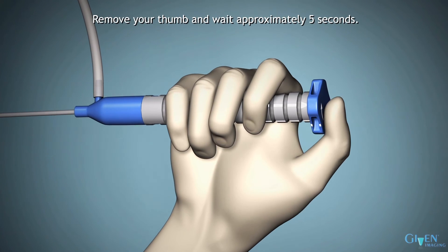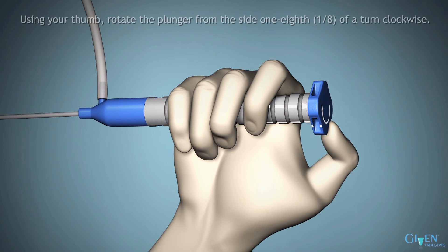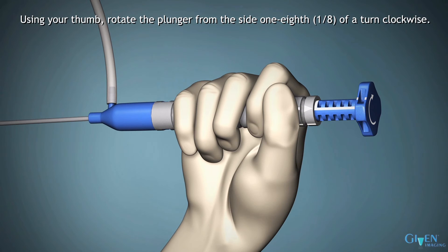Remove your thumb and wait approximately 5 seconds. Then, using your thumb, rotate the plunger from the side one-eighth of a turn clockwise.